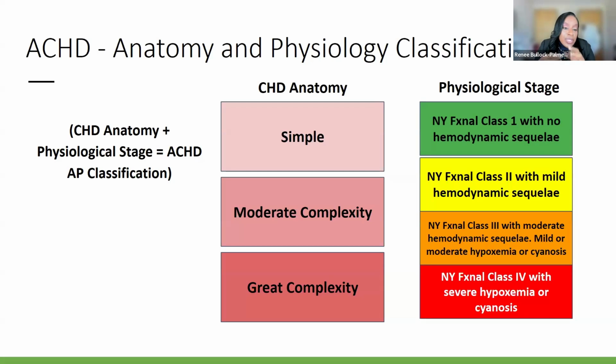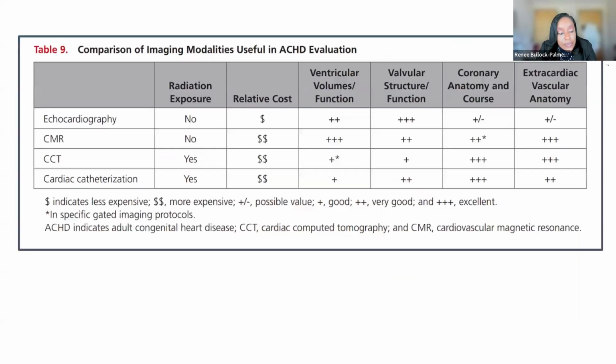So it's very important that you're understanding this when this patient is referred to you as an imager, because what you may select for that patient may be customized depending on what that patient can tolerate. There are some patients that just cannot tolerate acquiring a study on their back. They have to do more echo and something that's more by the bedside. So taking all of those features into play is very important as well.